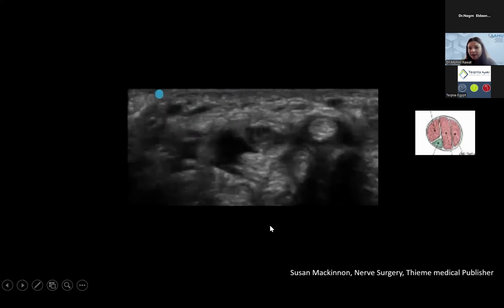But if you look at the references and see the topography of the nerve, which means how the fascicles are arranged at this site, this explains what we see in EMG. At this site, the nerve bundles are arranged like this. The red that you see are sensory bundles, and the green that you see are motor fibers.